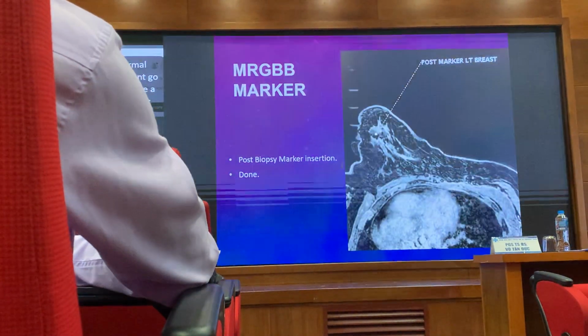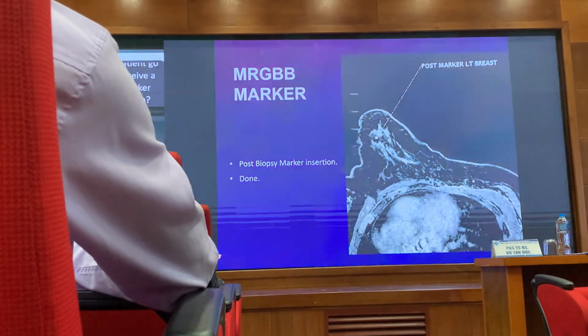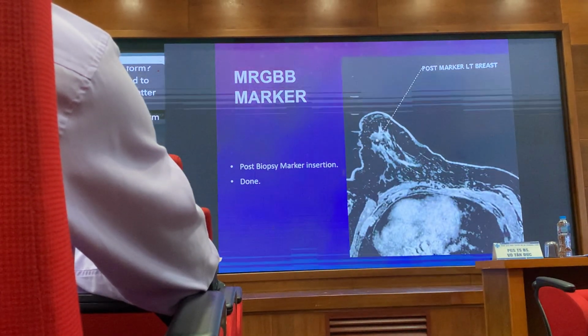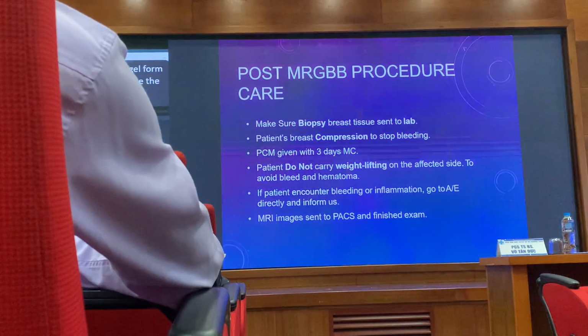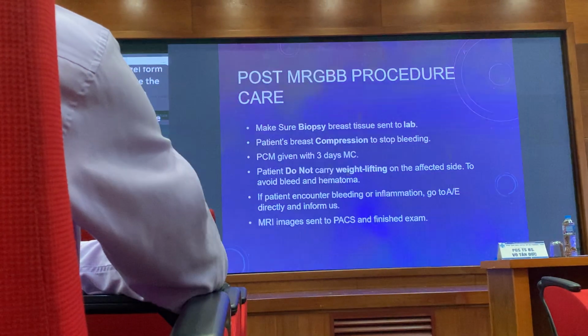And then this one, my radiologist also shared that we must put in the marker first, and only then follow with the gel foam. We cannot put in the gel foam first because it might disperse the marker to other places. So we put in the marker first and then we put in the gel foam. And done. Okay? We make sure the biopsy breast tissue will be sent to the lab.